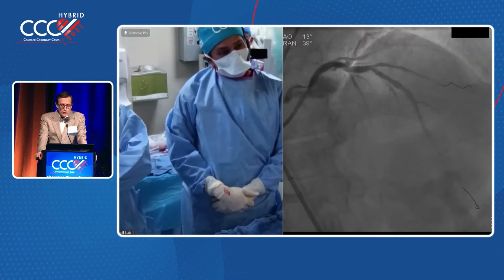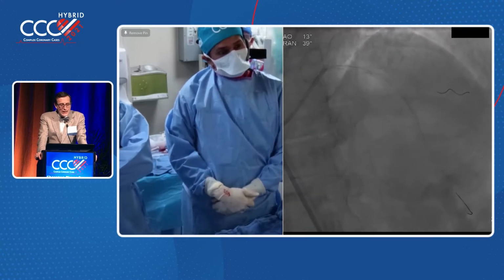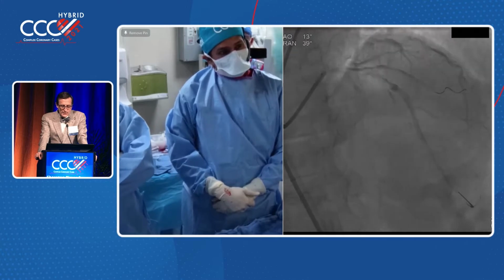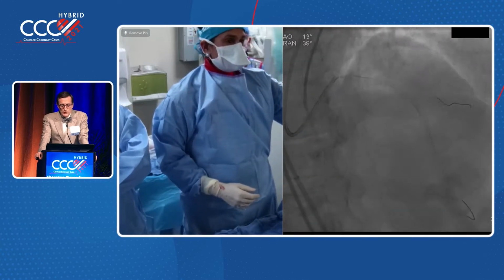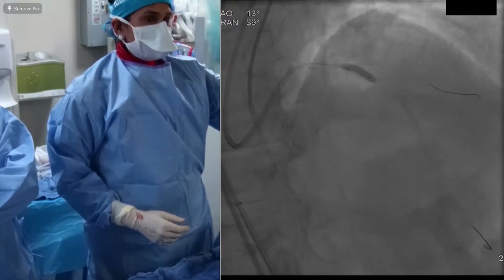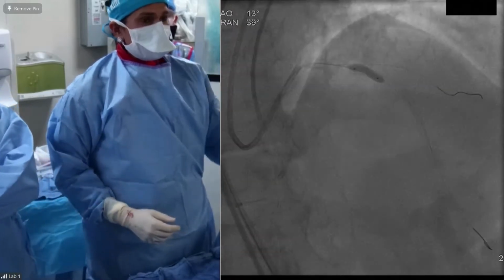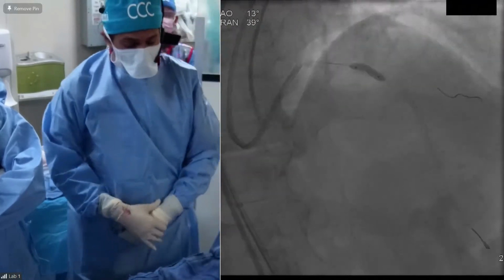The question is, if you put 1 stent, because of this eccentric calcium, are you really gonna expand it to 3.75 or something? Or it's gonna create a bump in that? And should you just put a V stent, not trying to make the distal main vessel match the proximal main vessel? 3.75 cutter or 4?